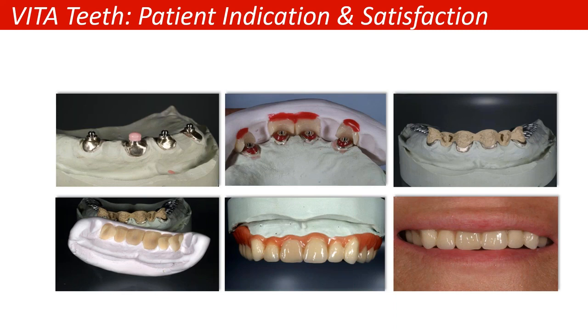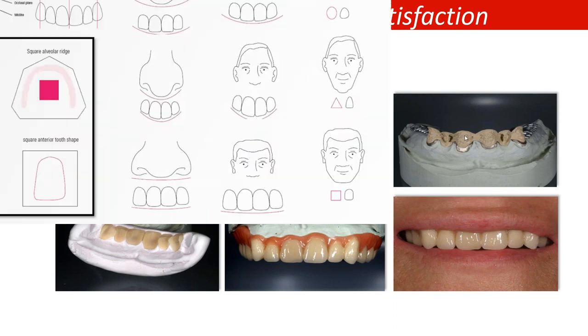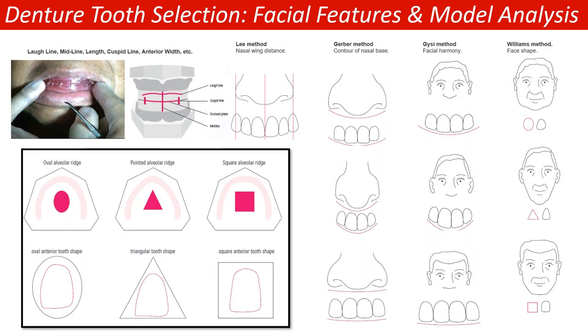So again, this is where you start choosing the tooth that matches the patient's requirements, the patient's indications, the patient's expectations. You're going to do all this work, and if you have too translucent of a denture tooth, the metal framework behind it is going to shine through. So you got to avoid that. Otherwise, you're ending up doing a lot of additional opaquing on the frameworks and so forth. And then, of course, we always continue to do the standard model analysis, look at the facial features to try to find out, again, what mold.